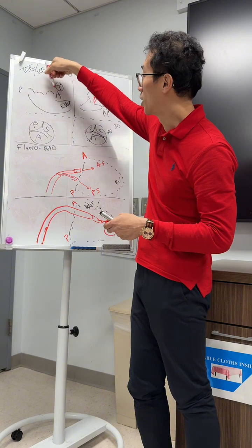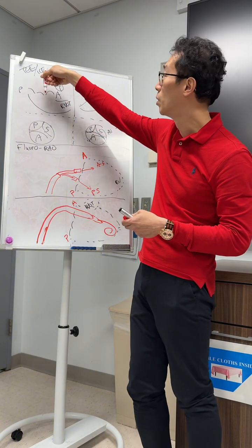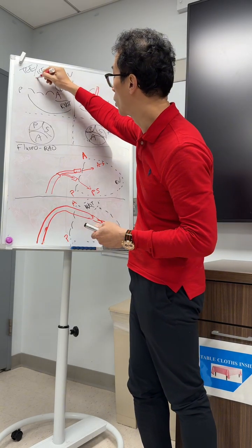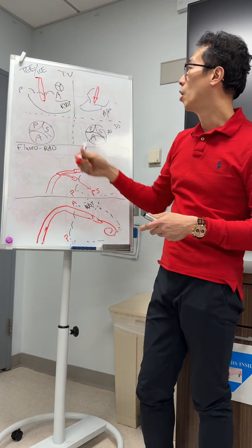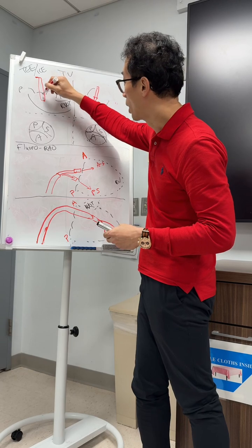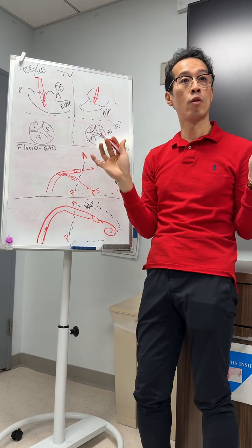This orientation here is anterior and posterior. It's nothing to do with septal lateral. So it's very important that you appreciate that, okay? So when you have your device across like this, let's just do an example here. What you need to tell the imager is the following. This is straight, correct? Everyone agree?